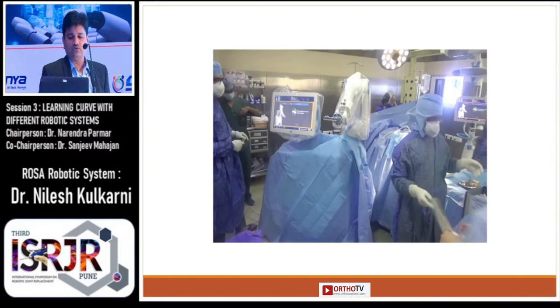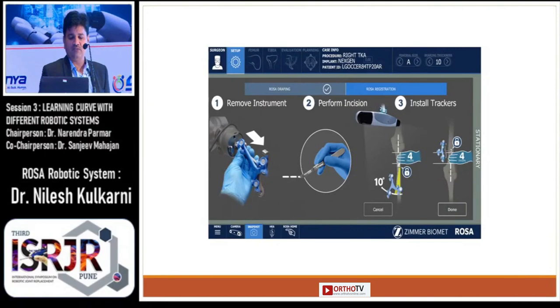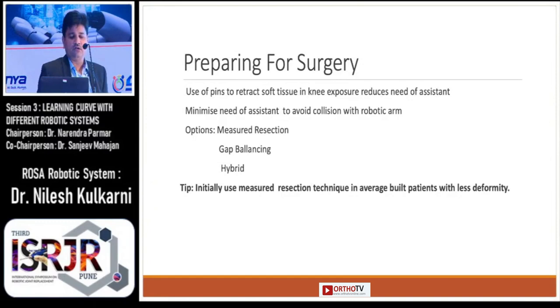You can see the ROSA is now ready for surgery. After doing the initial procedures, you can perform the incision and put the trackers. As Dr. Narendra Vajja has shown, use of pins to retract the soft tissues reduces the need of assistance, and reducing the need of assistance avoids collisions that affect the robotic arm.